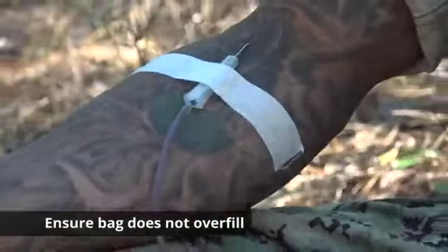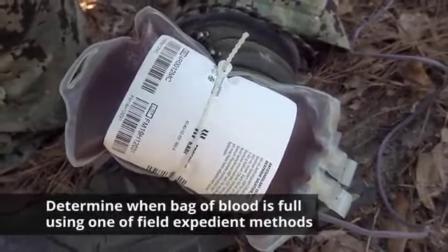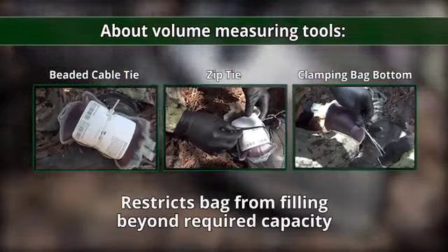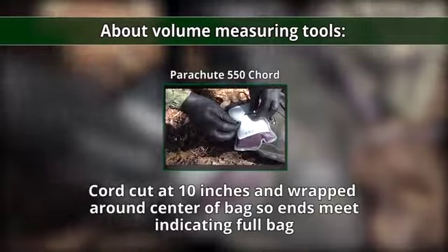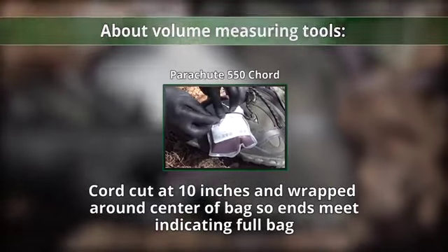Watch the bag to ensure it does not overfill. Determine when the bag of blood is full using one of the field expedient methods mentioned earlier. Note: the beaded cable tie, zip tie, and clamping the bottom of the bag restrict the bag from filling beyond required capacity. The parachute 550 cord is cut at 10 inches and wrapped around the center of the bag so ends meet, indicating that the bag is full.